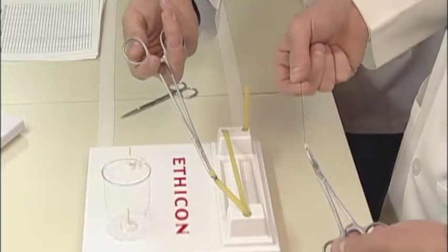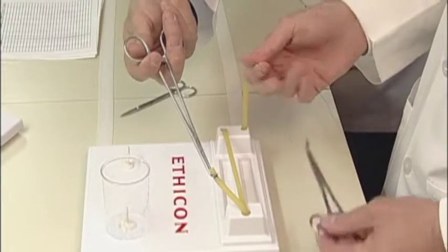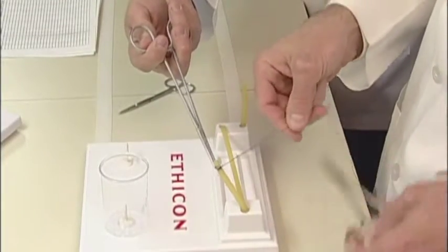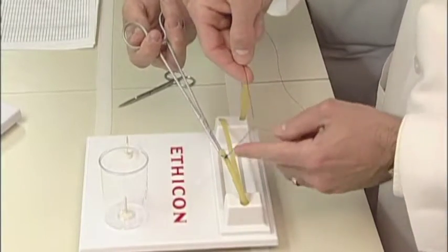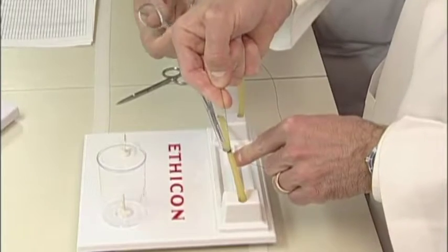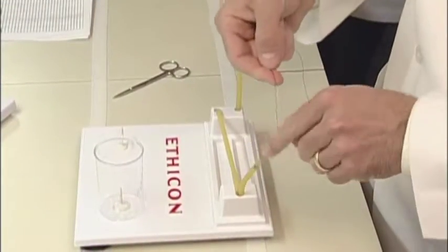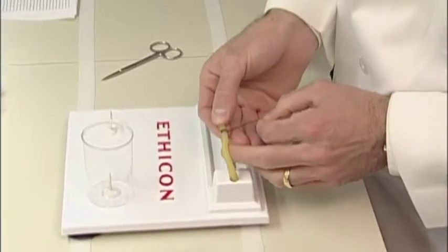We'll do another repetition of this task, and again I have the silk tie at the tip of the hemostat. I will pass my clamp around. My assistant is holding the right angle clamp, and I will tie down a knot, make sure that it's up snugly against the clamp, off, and then tie down a second and a third square knot, and then we can look and assess performance.